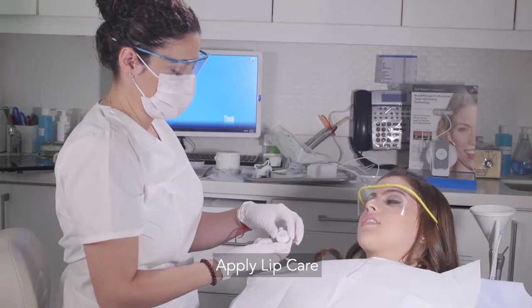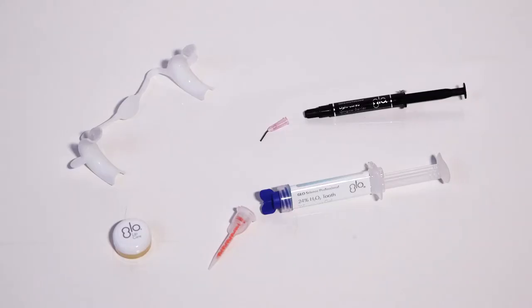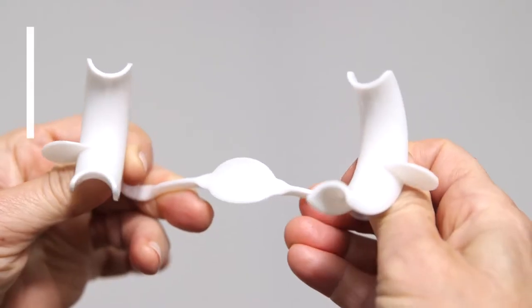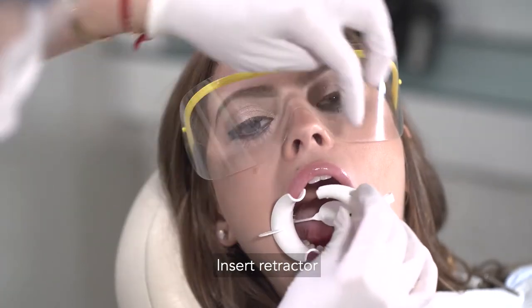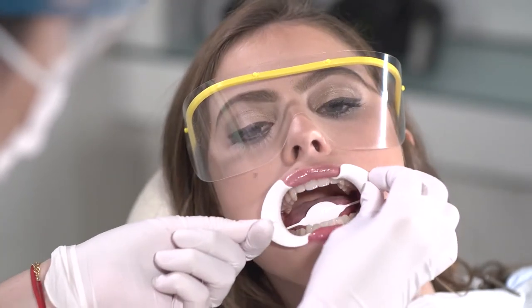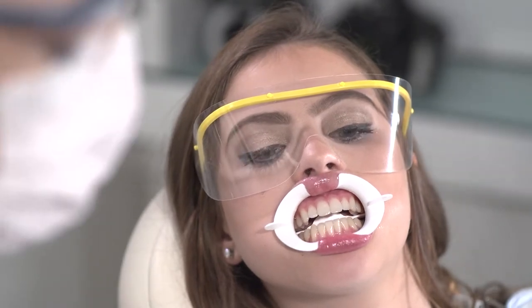Next, apply the Vitamin E and Aloe Lip Treatment to soothe the lips and protect the soft tissue. Insert the patented Glow Lip and Cheek Retractor that was designed especially for the Glow Whitening treatment. No other lip and cheek retractors should be used, as this one is designed to be flexible, fit any size mouth, and really easy for the professional to insert. The design prevents the tongue from moving forward for the ideal whitening treatment, and it's also autoclavable so that you can reuse it.